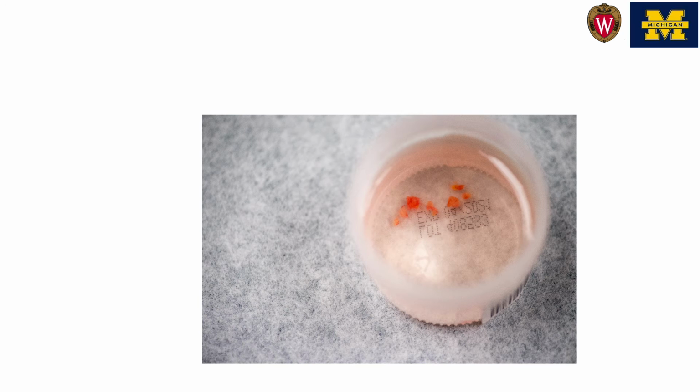Here's an image of labial salivary gland biopsies in their formalin container about to be shipped off.